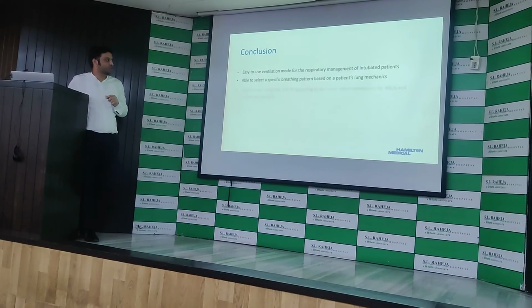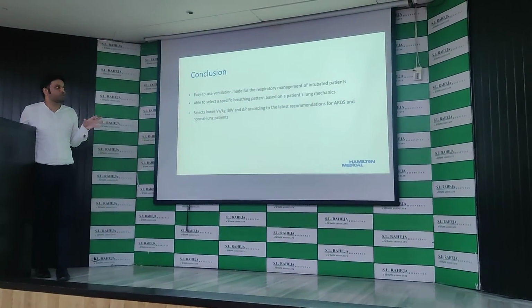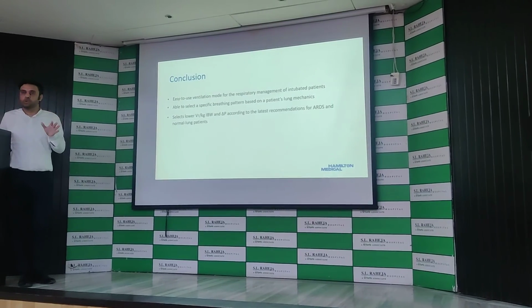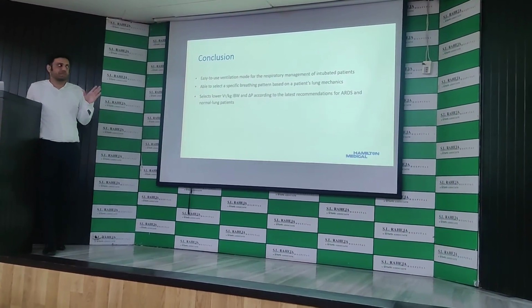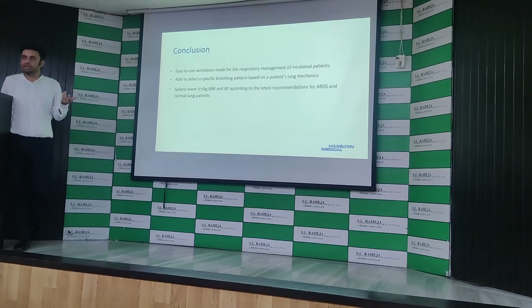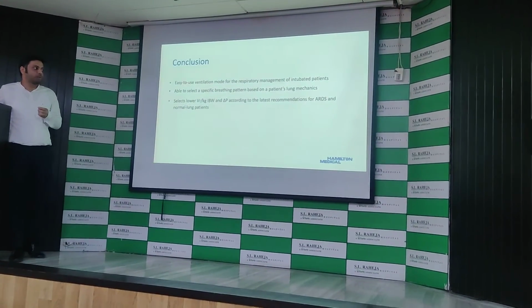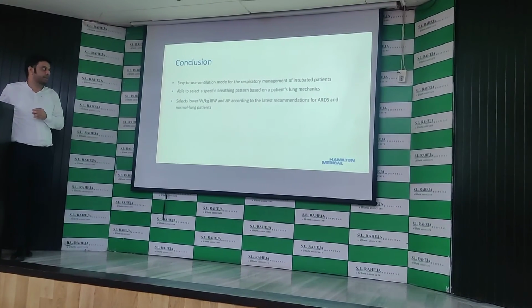So ultimately, what is the conclusion for this? This ASV mode is an easy-to-use ventilation mode for managing respiratory patients, especially intubated patients, and it is able to select a specific breathing pattern based on the patient's lung mechanics, as per the expiratory time constant. Because with that we measure the patient's lung mechanics, and moreover, it is able to select lower volumes as per the ideal body weight and change the pressure according to the latest recommendations for ARDS and normal lung patients.